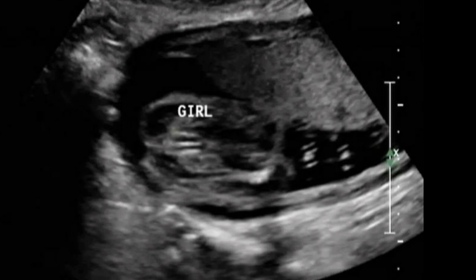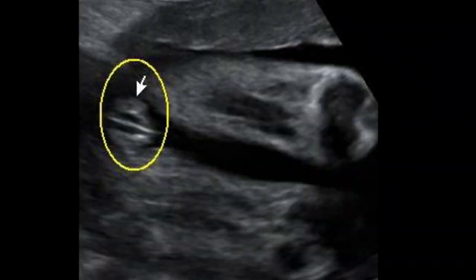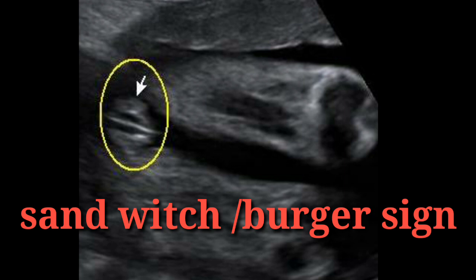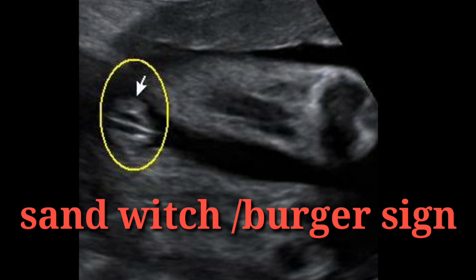You can see in this picture a female baby showing the sandwich or burger sign. You have to look into the burger sign — there are three whitish lines. You need to focus on both femurs and between them, manipulating your probe to see the burger sign. Come and see how we appreciate the female sex on ultrasound.